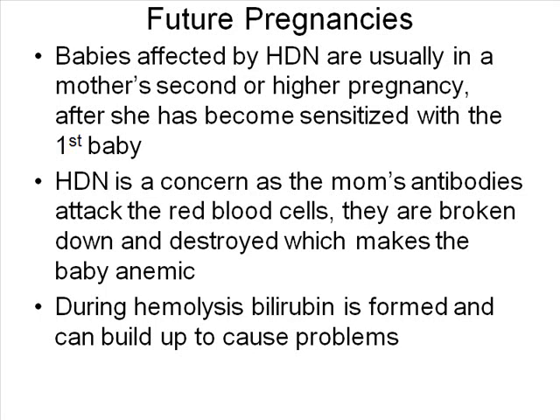And usually those are the babies then. An ABO is done, an Rh, a direct antiglobulin test to determine does this baby have a positive direct Coombs, an elution to see what antibody is on the red cells, and then a possible exchange transfusion.